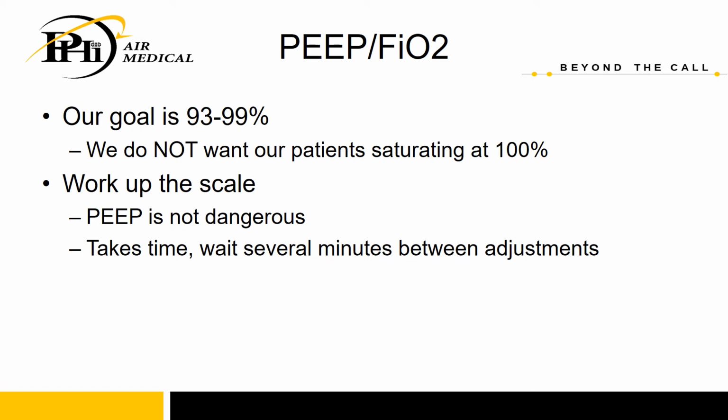PEEP is not dangerous, but it does take several minutes, so go ahead and wait between adjustments. So we're not going to increase our PEEP from 8 to 10 to 12 within a 2 to 3 minute span. We need to wait for all of that recruitment to take place, and that takes several minutes each time you make an adjustment.